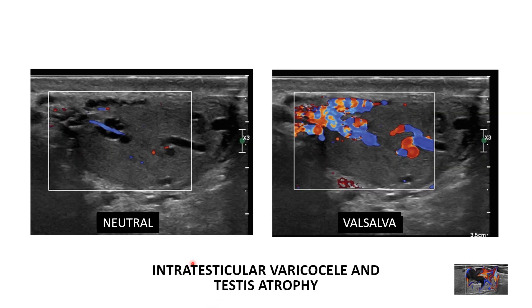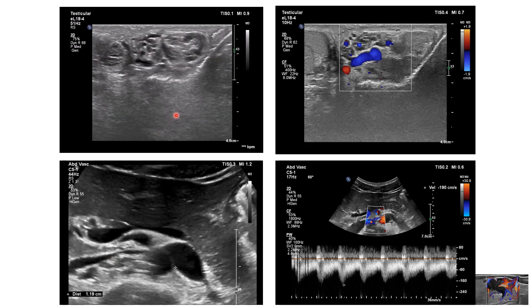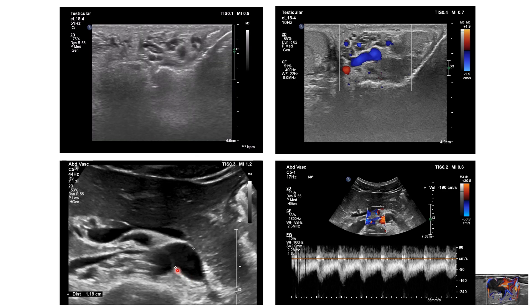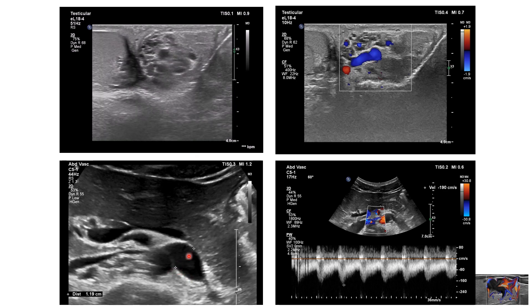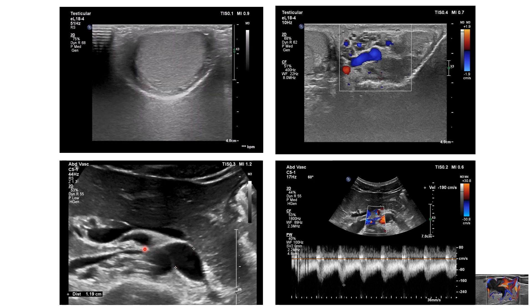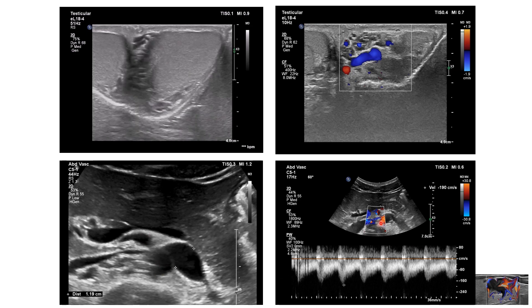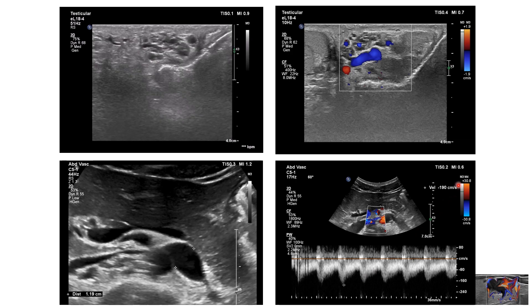Here is an example of intratesticular varicocele with dilated tubular veins inside of the testis and testicular atrophy. You can see the veins are filled during the Valsalva maneuver. This is an adolescent male with varicocele where the cause is nutcracker phenomenon. The left renal vein is enlarged due to compression between the superior mesenteric artery and the aorta, and you can see turbulence in the vein and increased velocities.